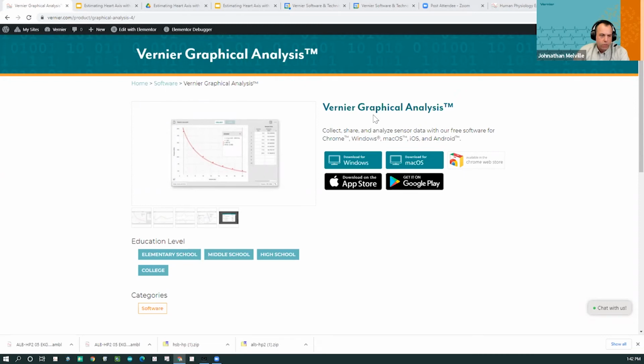Yes. So the question was, so we'll be able to compare the data, not share it. Well, technically you could still share it, just not share it as easily. Right, so you could record the data. Students could record the data. You could have that data file and they could save it and they could email it to each other. It's just a lot easier if you wanted to do it in real time.